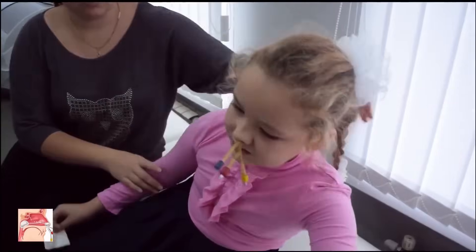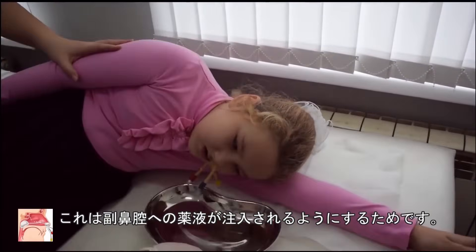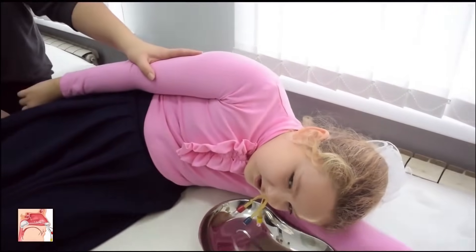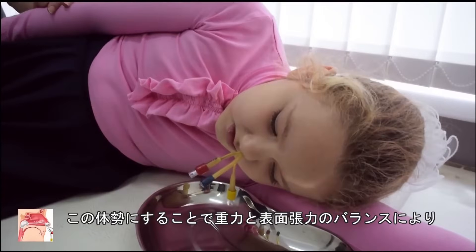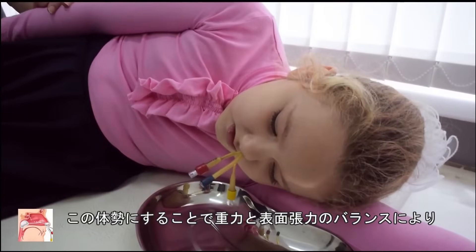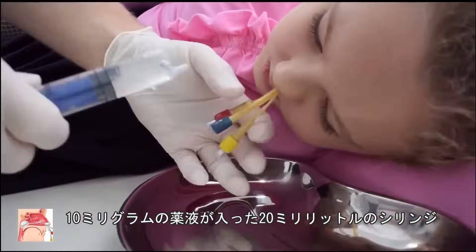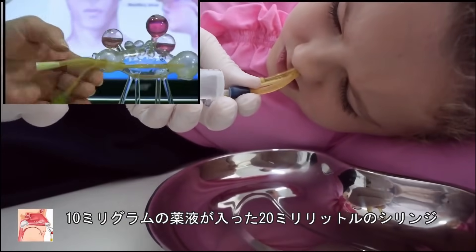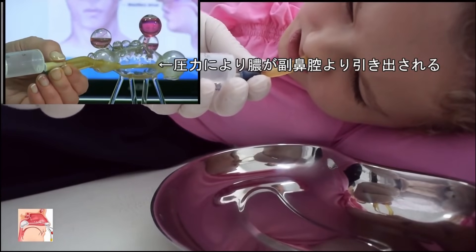For injection of the drug into the sinuses, the patient should be placed in the lateral recumbent position on the same side as the sinuses to be injected. In this position, the drug will fill the sinuses due to a balance of gravity and surface tension. A 20-milliliter syringe filled with 10 milligrams of the drug solution should be attached to the working channel of the catheter.